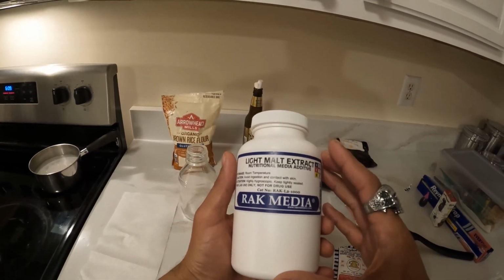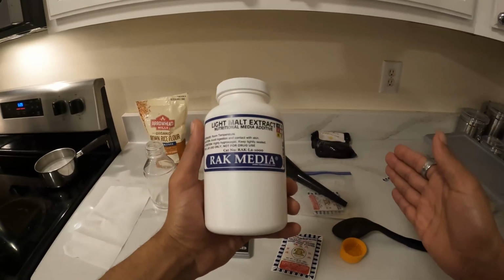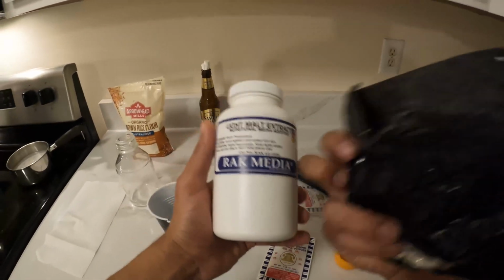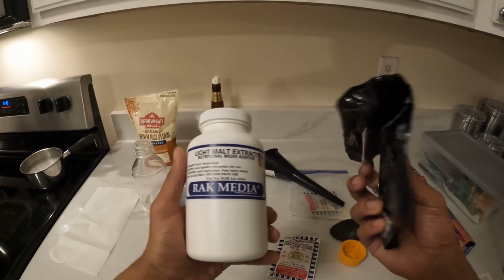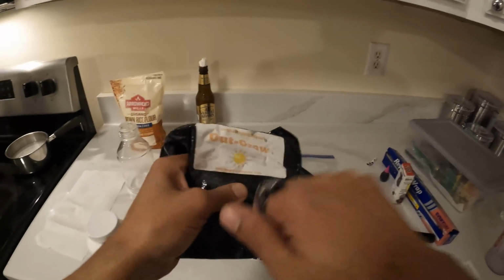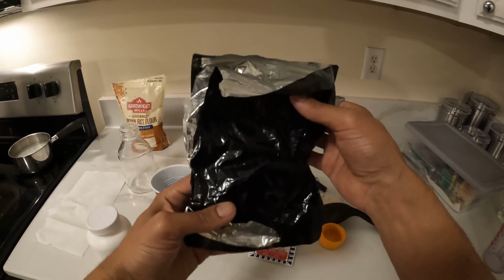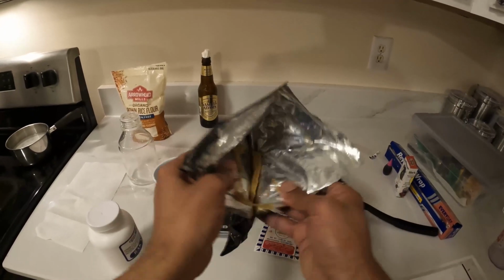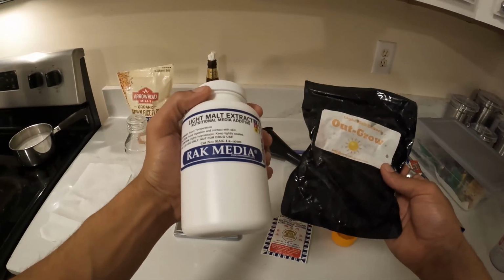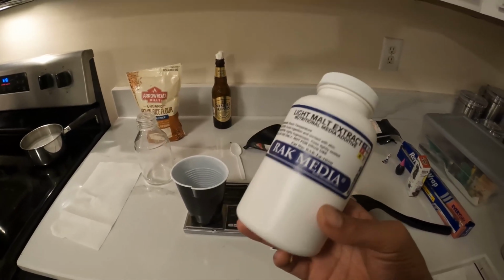This is light malt extract, and if you're going to use light malt extract, which is a little bit different than the regular malt extract, this is my third favorite recipe. Make sure you get it in a container like this, or you put it in a container like this, because what happens is it's going to get exposed to air, and then it's just going to harden up, and it's a waste. There's nothing I can do with this. I just wanted to show you guys. If you're going to order it, make sure you order it and get it in a bottle as soon as possible, or just go ahead and order it in a bottle. And that's light malt extract, my third favorite recipe.